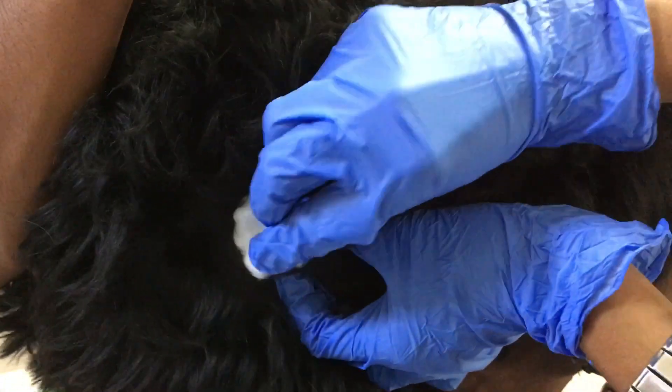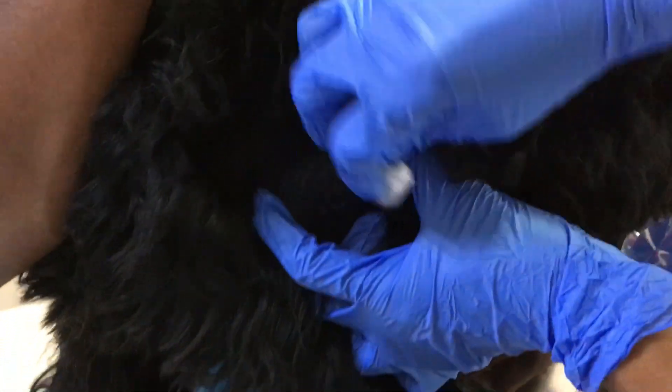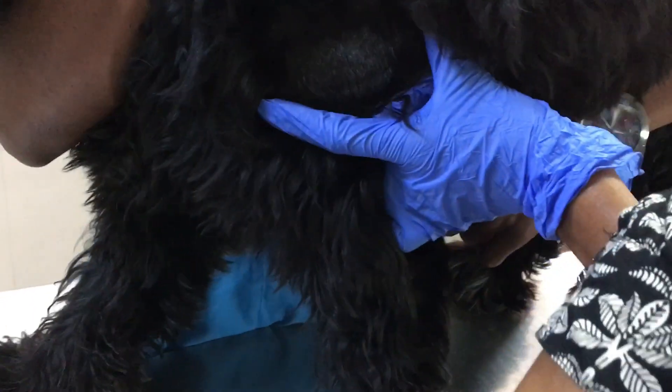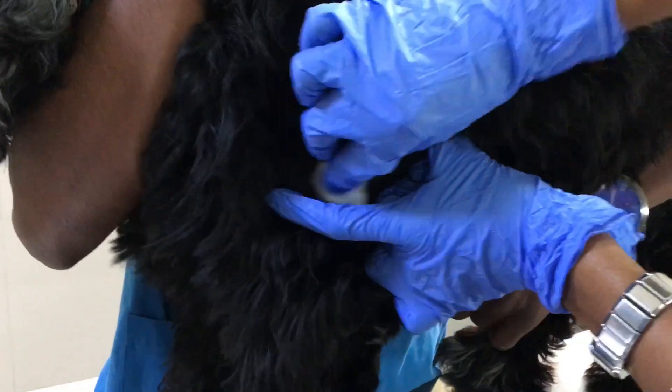The area to be sampled will be cleanly shaved. Then the site will be sterilized using betadine and surgical spirit.